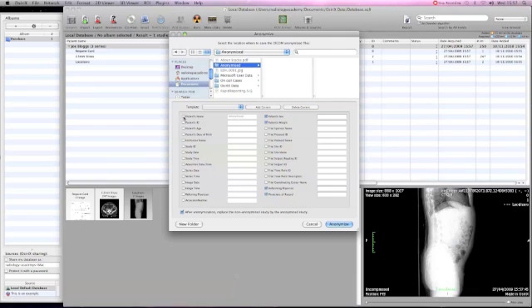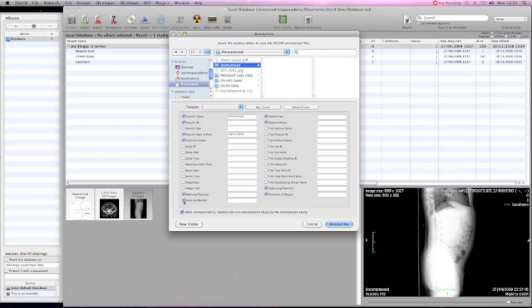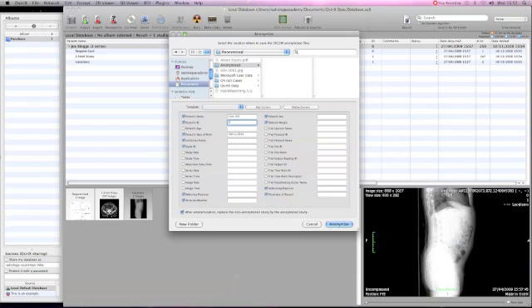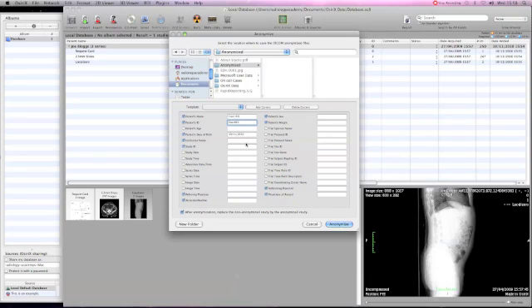It's important that we anonymize many issues: the patient's name, the patient's ID, the patient's age and date of birth, the institution, the referring physician, the accession number, and also the study ID. At this point, in the anonymized area adjacent to the patient's name, we need to give this patient some identifier for future reference - let's say case 001. Then we will anonymize that patient, saving the patient data to the anonymized folder. We're also putting the duplicate of the patient data into the patient ID folder to prevent future problems with importation. It's not something we need to worry about now, but it's advisable that we do this.